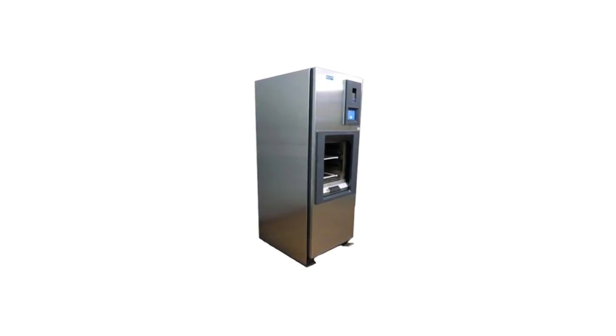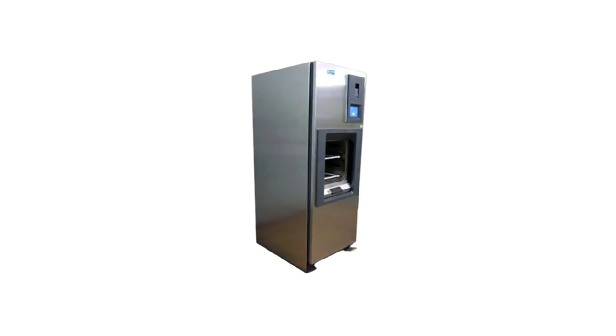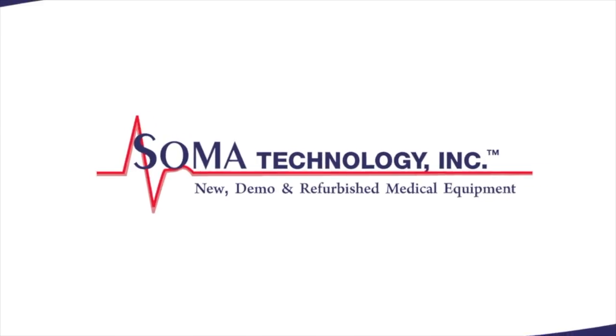To view more information about the Steris Amsco Century V120 or other products, please visit somatechnology.com.